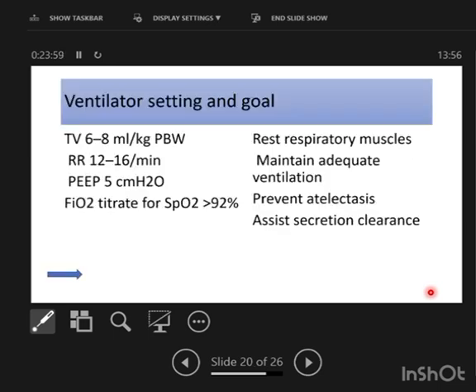What care you have to take is secretions. You have to avoid secondary infection. The GBS patient will die because of ventilator associated pneumonia, if at all it happens in the ICU. So you have to have a good ventilatory care bundle. You have to teach your sister to change the patient's position adequately. You have to mobilize. We mobilize the GBS patient on bed, out of bed, on pressure support. You can make him sit in the chair.